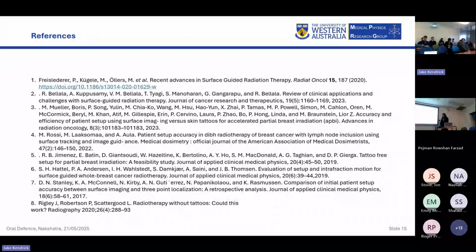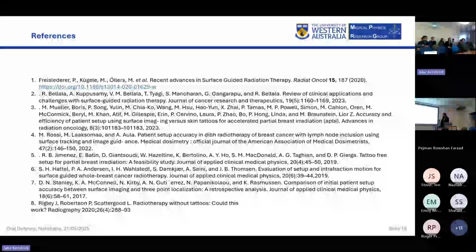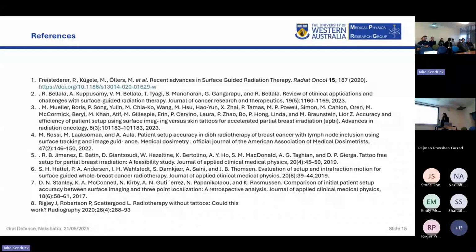Is there generally a one-to-one relationship between the surface and the anatomy underneath, or does the anatomy underneath sometimes shift relative to the surface? It can shift. It doesn't have a clear ending, but in the end, for radiation therapy, IGRT alone cannot give a clear understanding of the whole treatment. So surface guidance also aids the accurate position, right?